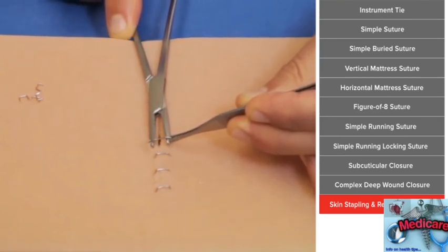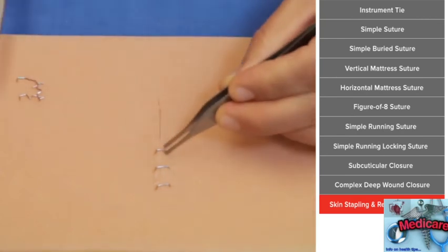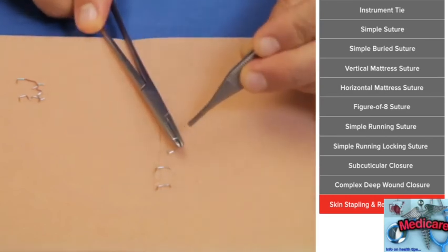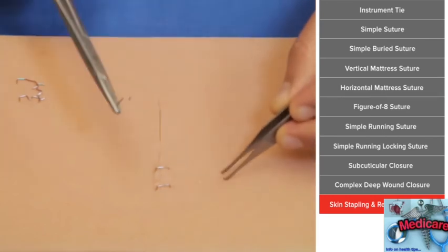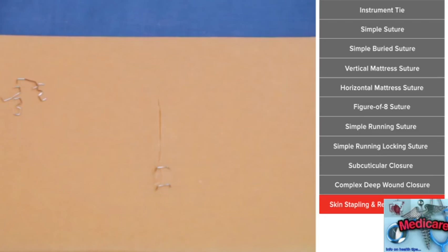And here's an example with just a needle driver where literally you just spread, so you're trying to open those tines, and as it does, it'll come out. If you're going to do this, it's usually better to do this on a patient who's asleep, because it can hurt to remove staples this way. And again, sometimes you do need to kind of rock from side to side, just in case one side is not completely open.